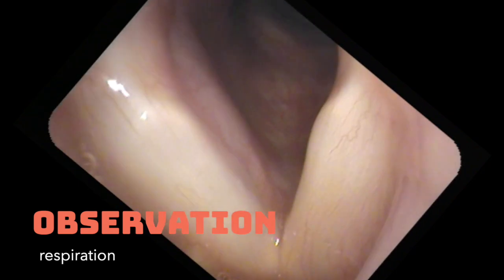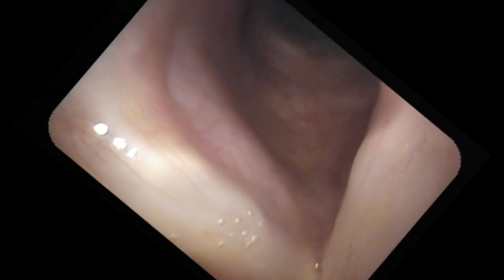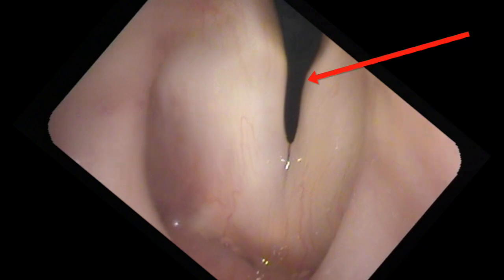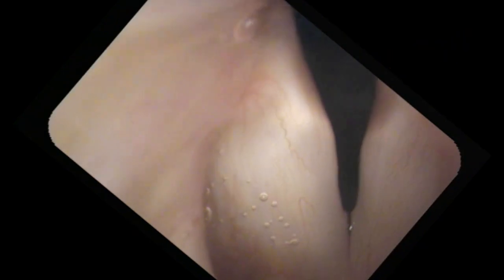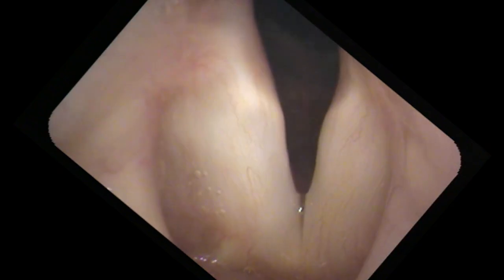And here we're watching, the right side is acting normally. The right vocal process during respiration is completely opening during inspiration and closing during expiration. And the left vocal process is perhaps moving, and it is moving at the correct time. It is moving medially during expiration and laterally during inspiration, but the degree of rotation is minimal when compared to the right side.